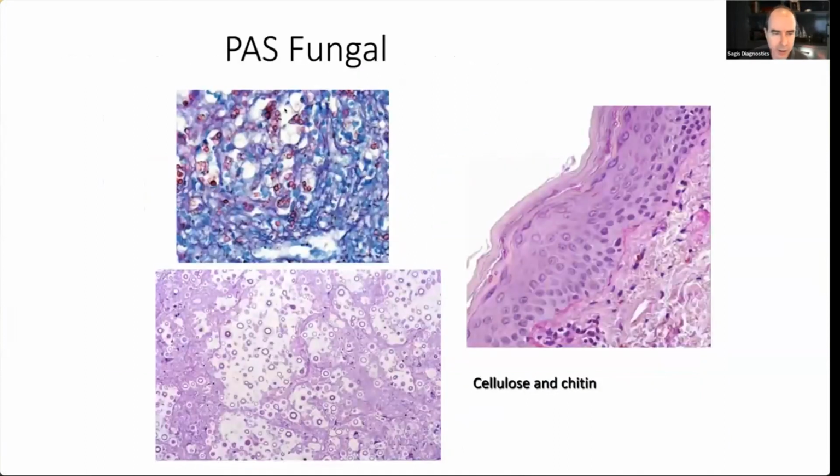And here's some fungal element staining to get your eyes used to this. So here is the epidermis, here's the cornified layer, and sandwiched in between two layers in the cornified layer are hyphal elements. So this is a dermatophytosis. And we call this the sandwich sign here because you often get either a splitting or a difference in the character of the cornified layer. It's often compact orthokeratosis below the fungus and either a less dense or a second layer above it. And sometimes you'll even have the basket weave orthokeratosis of normal cornified layer here. We call that the sandwich sign.